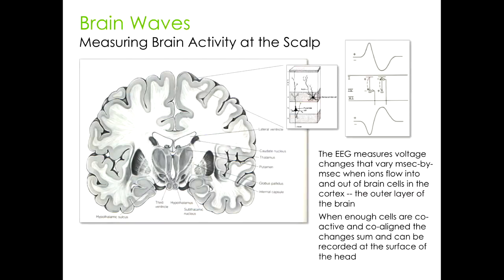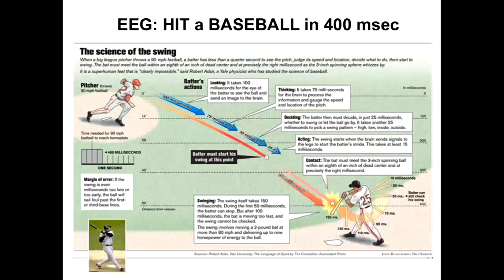As we discussed, the EEG is being generated in the cortex of the brain, and we'll go through a few slides as to why that is. It turns out it has to do with the geometry of how cells are. In the cortex of your brain, your cells are lined up in parallel. So when they fire, all their activity sums. In many other parts of the brain, for instance, in the basal ganglia, the cells are more randomly distributed. So as they fire, their fields don't line up. They cancel out locally. So we don't pick up anything on the surface of the brain. And this activity here produces various signals on the surface of your brain, which we can easily pick up and record. And they have a powerful connection to many behaviors, which I'll talk about in a little bit.